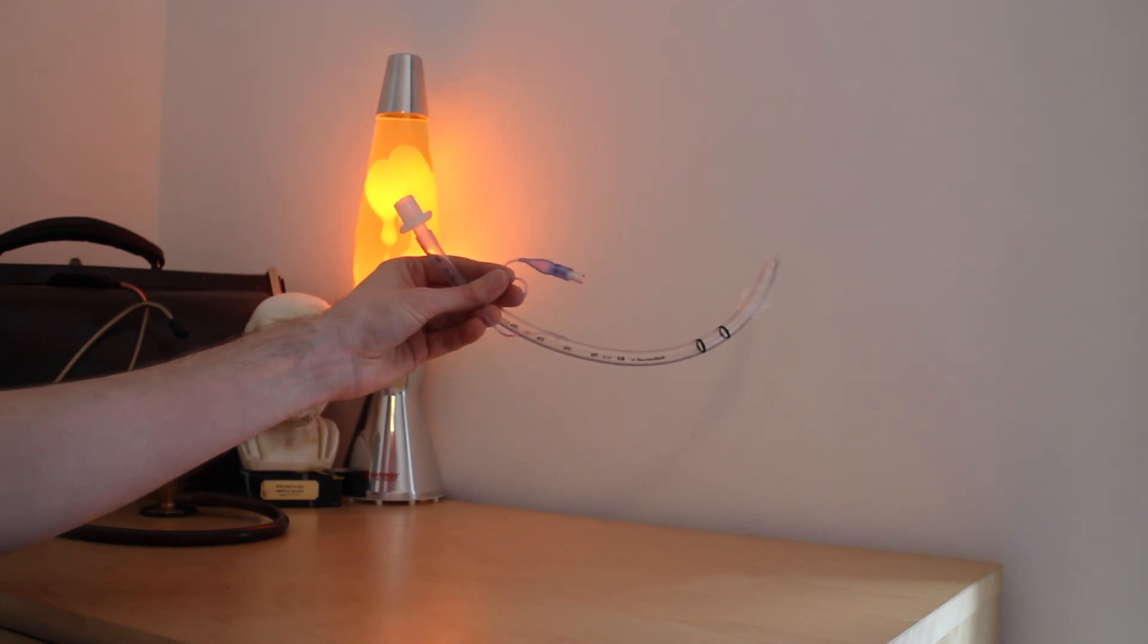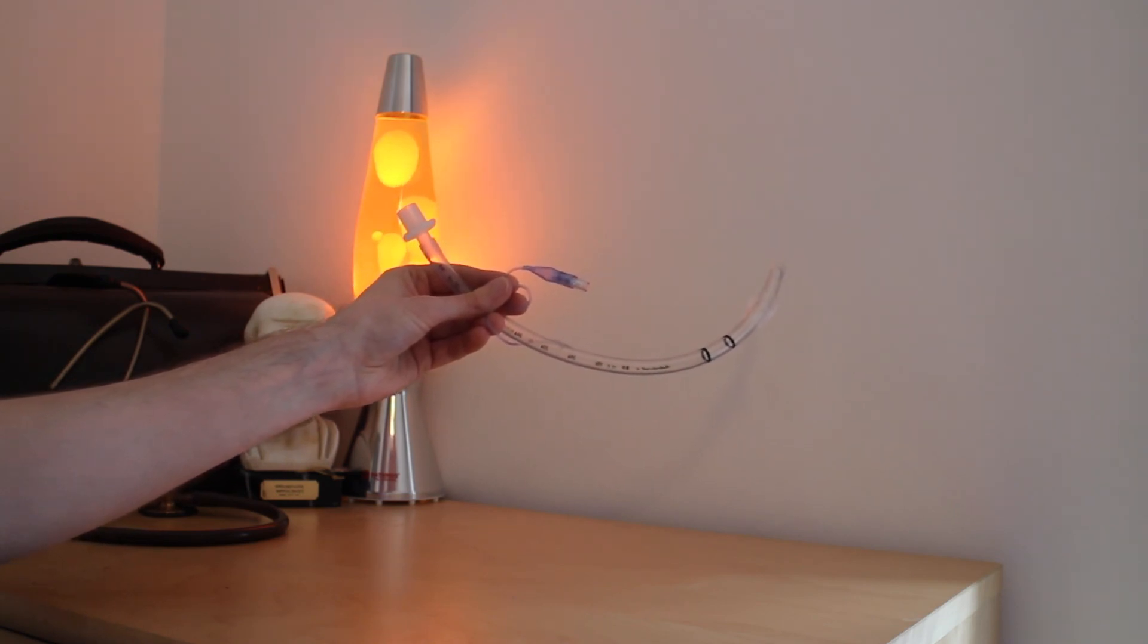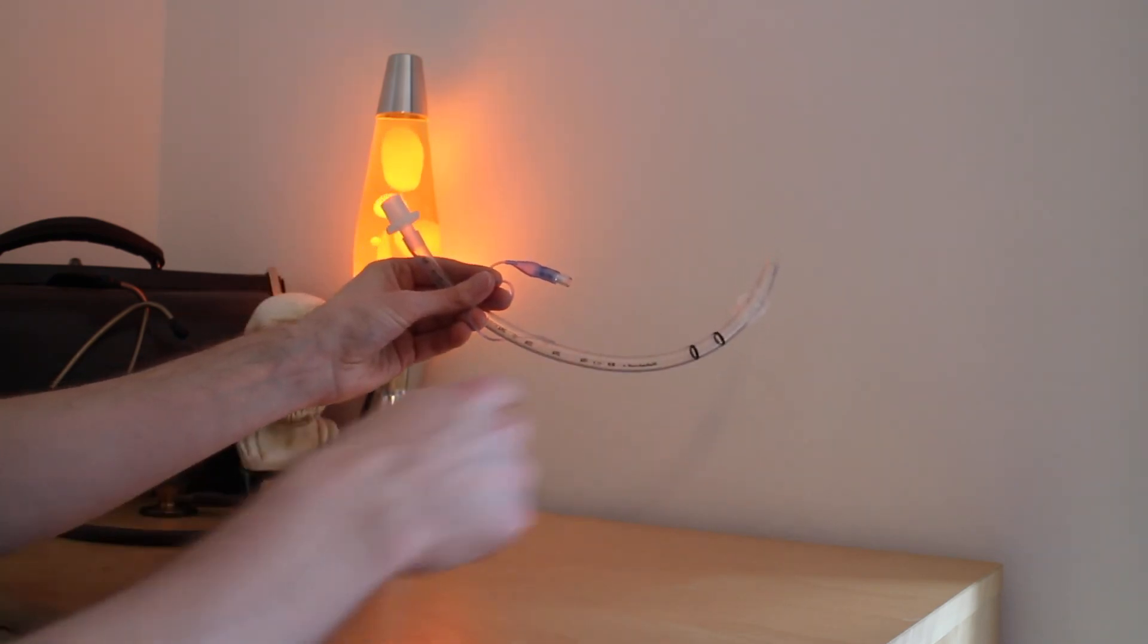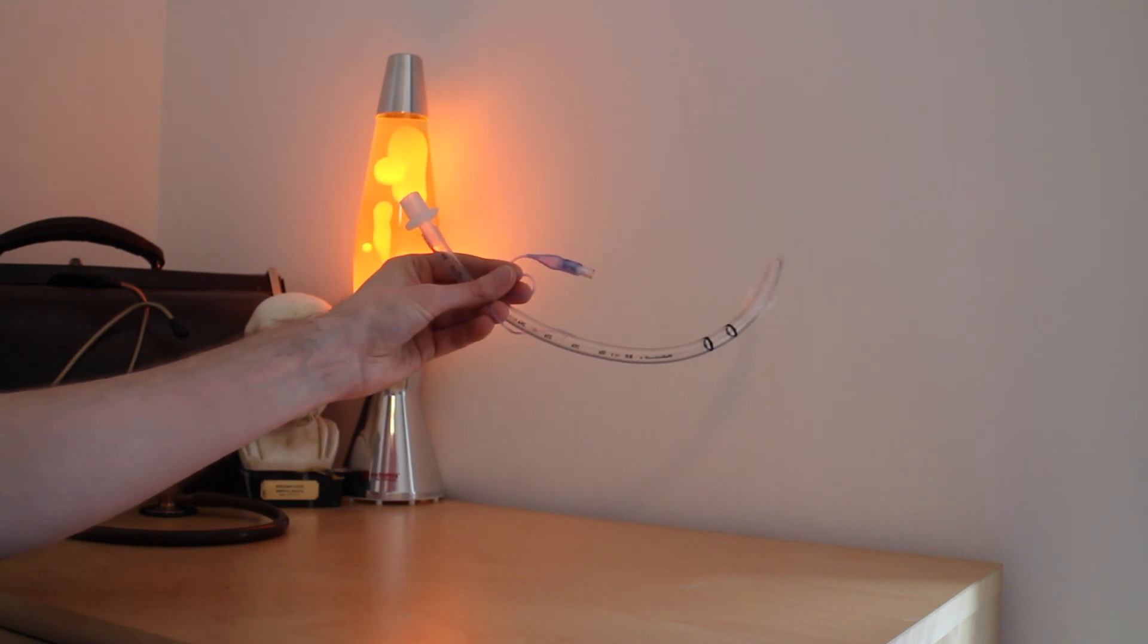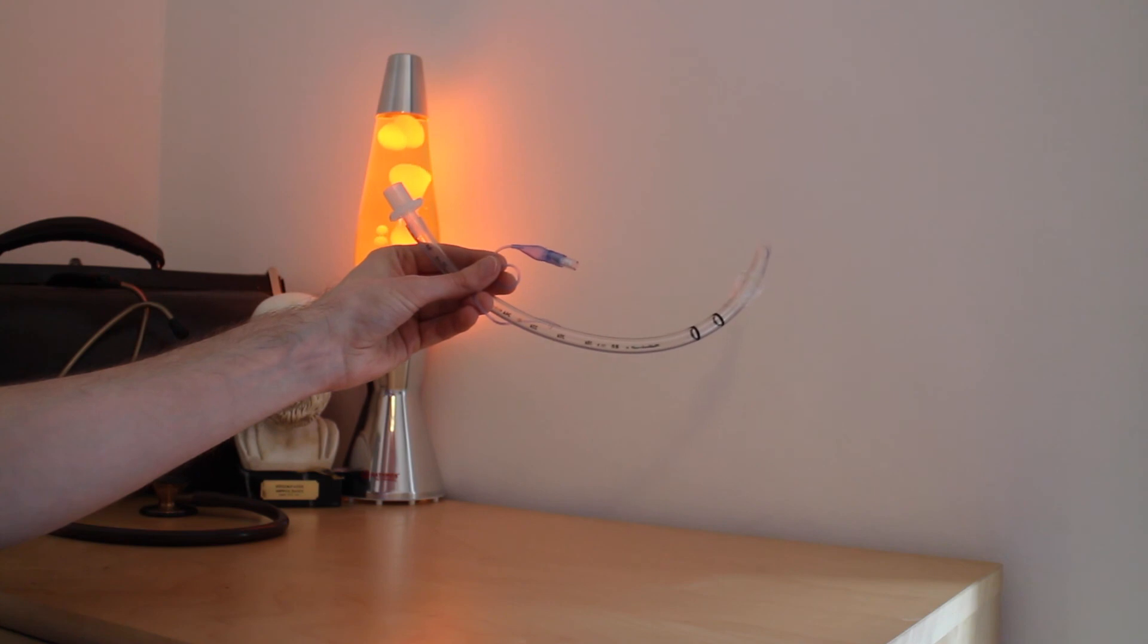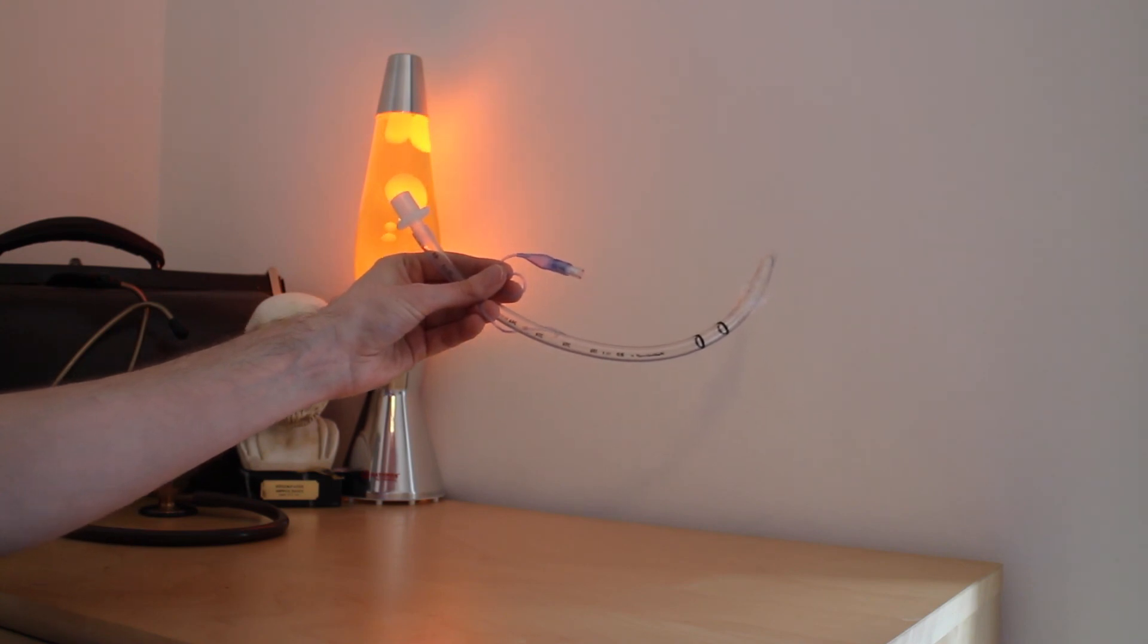In summary, this is a sterile single-use ET tube or endotracheal tube. It is used to provide a definitive airway during procedures such as a general anaesthetic, or in an emergency situation it may be used in patients with cardiac or respiratory arrest.